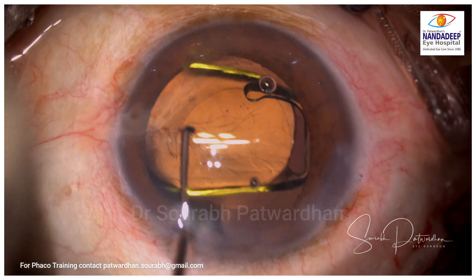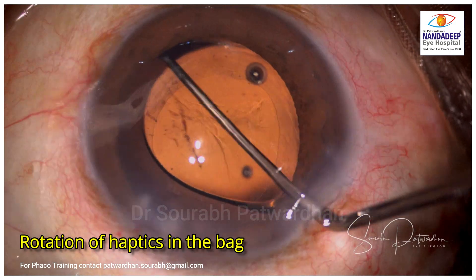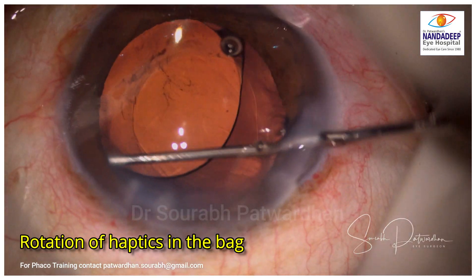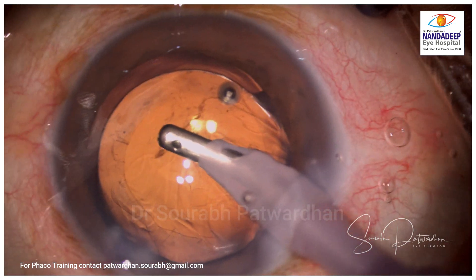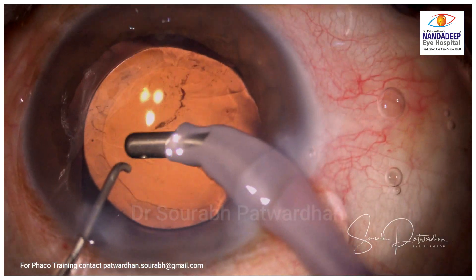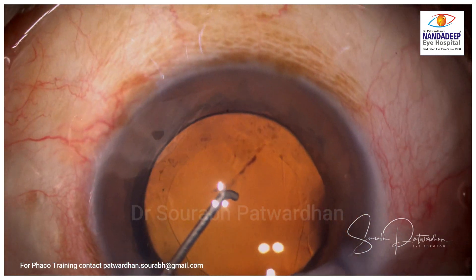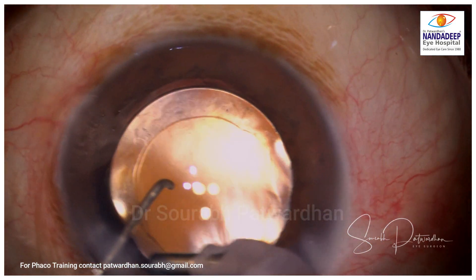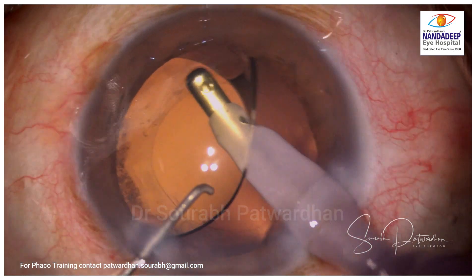Once I put the IOL in the bag, I rotate it, because the haptics will also clear off some of the cortical matter residing in the equator of the bag in the far periphery that is not visible and may be stuck. This movement of the haptics against the equator of the bag is quite useful to release cortex, and you many times find that more cortex comes off once you dial the IOL. You can dial it two or three times if you suspect cortical remnants. Then we go under the IOL and remove all the viscoelastic — you may find more chunks following — and remove them.